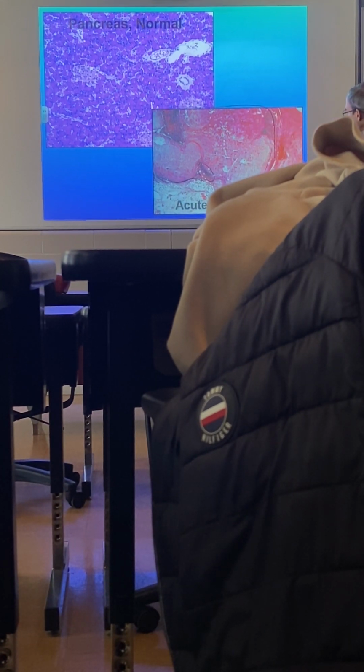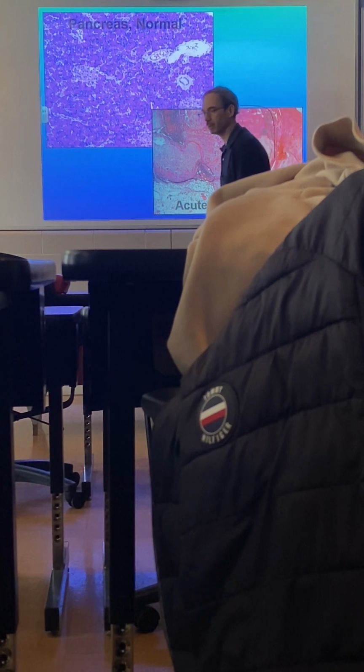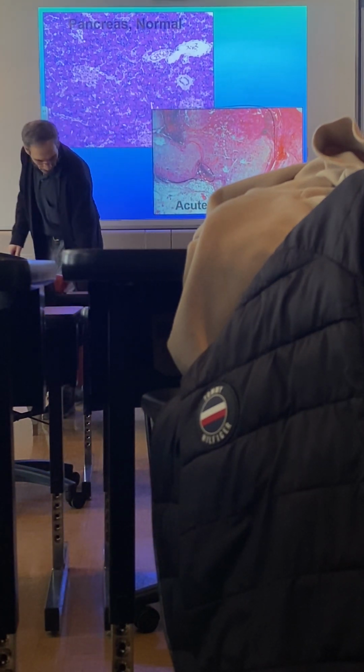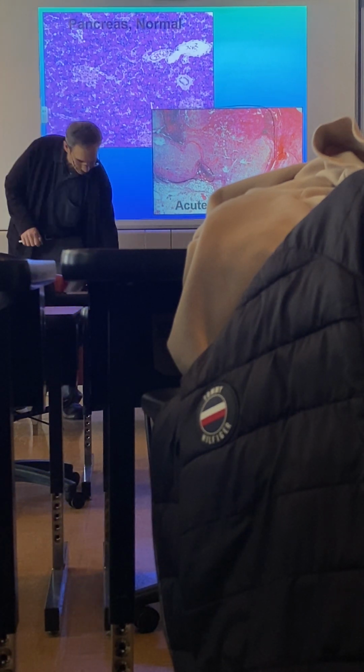Out here, you can see part of the retroperitoneal cavity. There's a lot of blood here. There's also some peripancreatic fat out here. This is where the pancreas is supposed to be, and it's just nothing but liquid. It's liquefied simply because of all the enzymes having digested. Should digest.